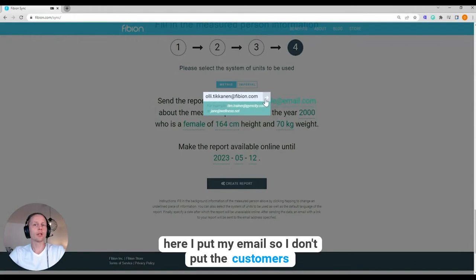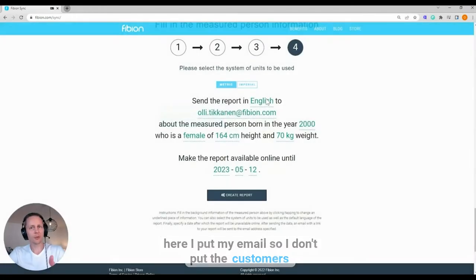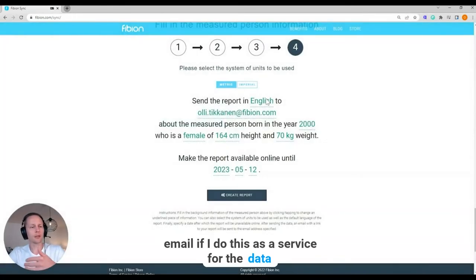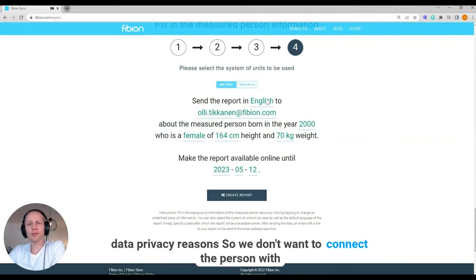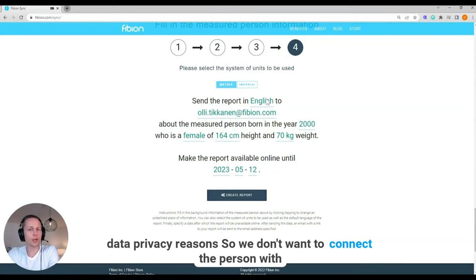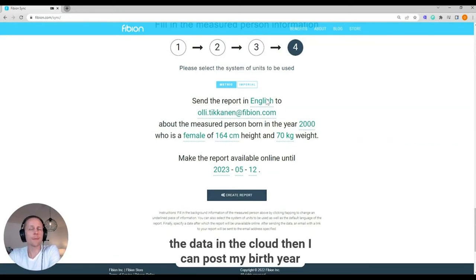So I don't put the customer's email if I do this as a service for data privacy reasons. So we don't want to connect the person with the data in the cloud.